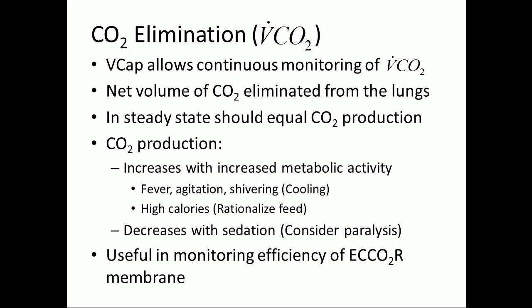Finally, I'm going to touch upon the virtues of using CO2 production. It's a very useful variable, particularly in those patients who you're struggling to ventilate and you're really at the cusp of where it is acceptable, the levels of pressure that you're delivering, and you're at the cusp of protective lung ventilation. The beauty of using CO2 production as a marker is that it's exclusively produced in the mitochondria.